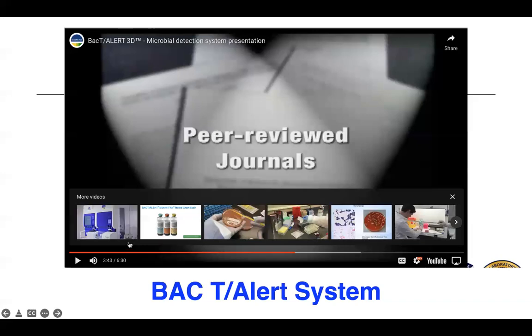Okay, so this is also quite a machine. It allows the laboratory to observe and await positive outputs, so you don't need to go and check in on it every time, except of course if there are error signals. But when positive cultures are present, it gives out a sound signal and then visual signals as well. The machine would also light up, same with the computer system that's attached to it.